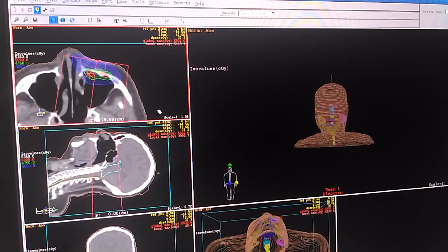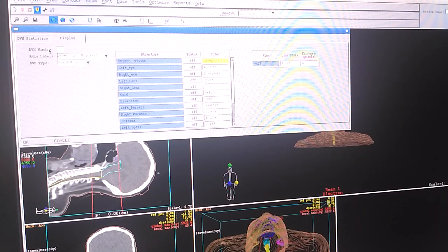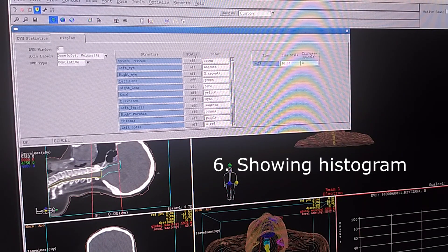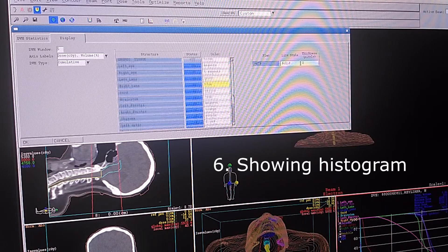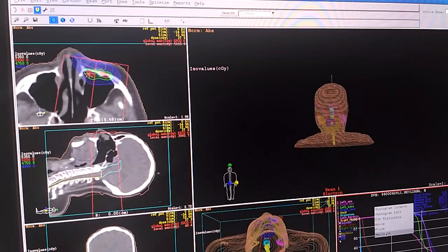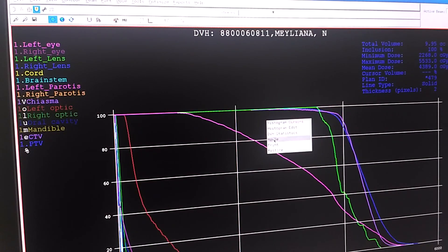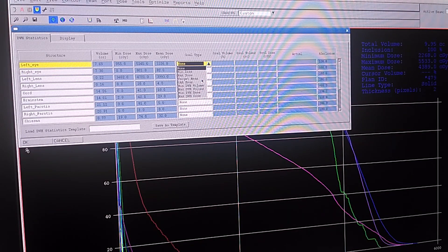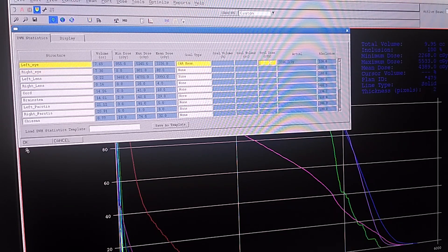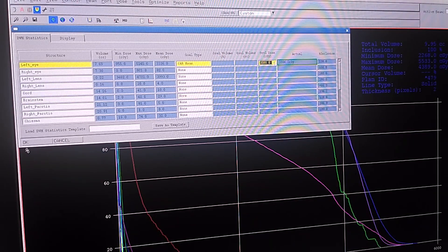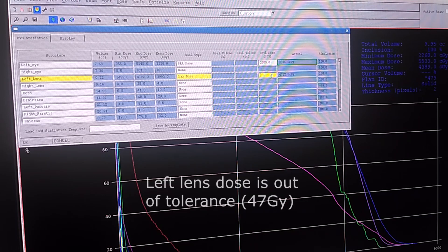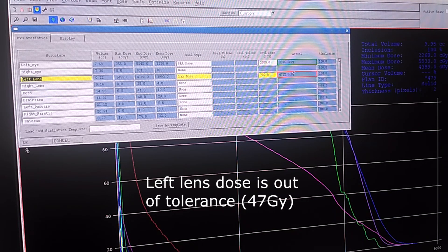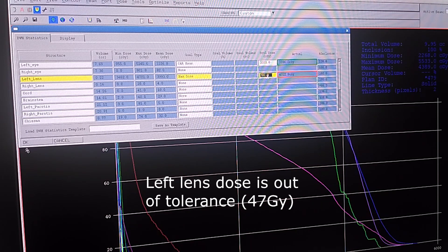The next step is we are going to analyze this one using a histogram. I'm going to put in the fifth window and activate all of the structures. We click OK and then we can analyze it in more detail using DVH statistic. Our main concern is the eye, the left one. The globe is safe but as you can see the left lens, it's significantly higher than allowed dose which is 47 gray compared to 7 gray.